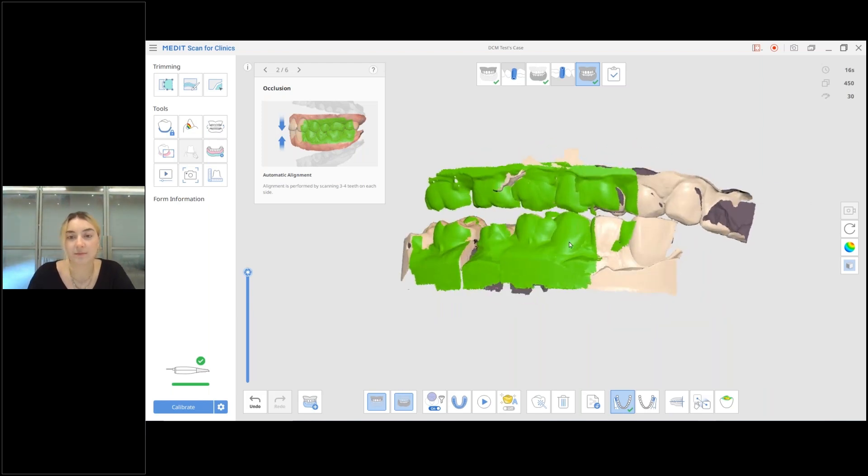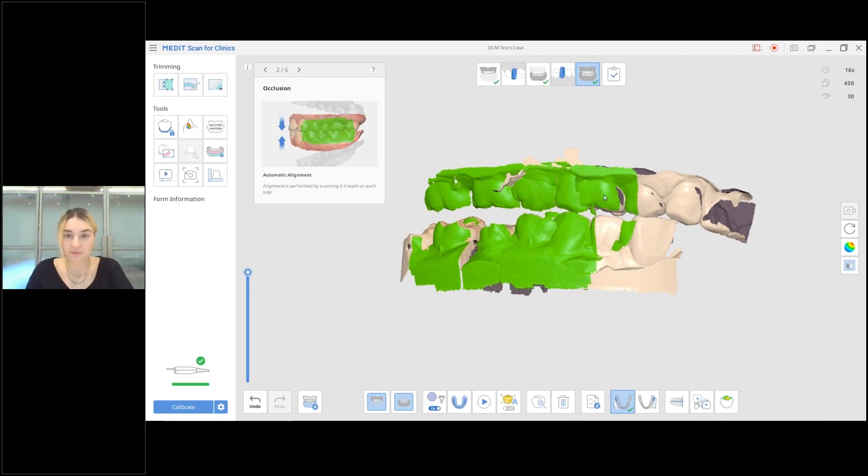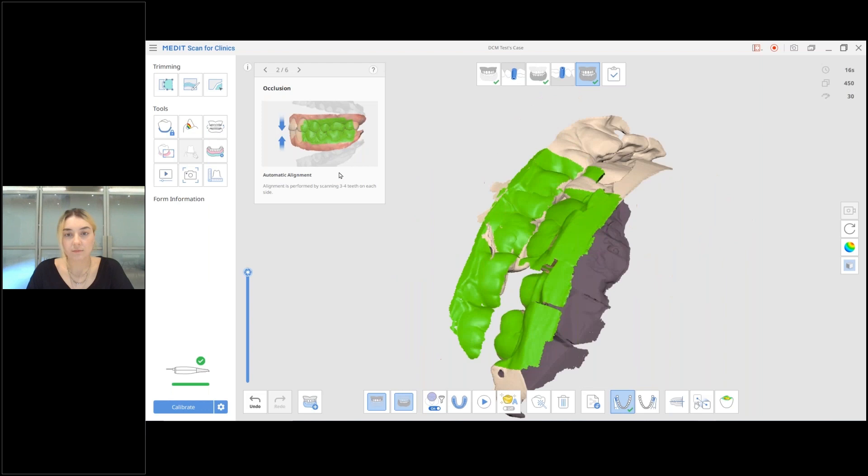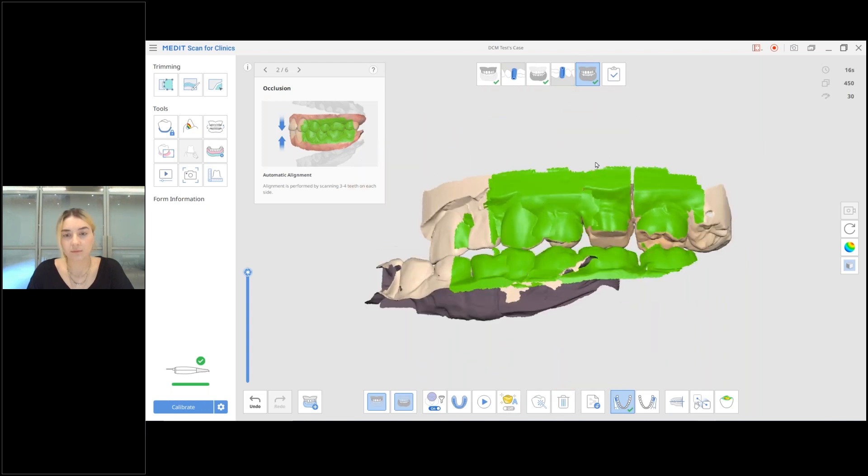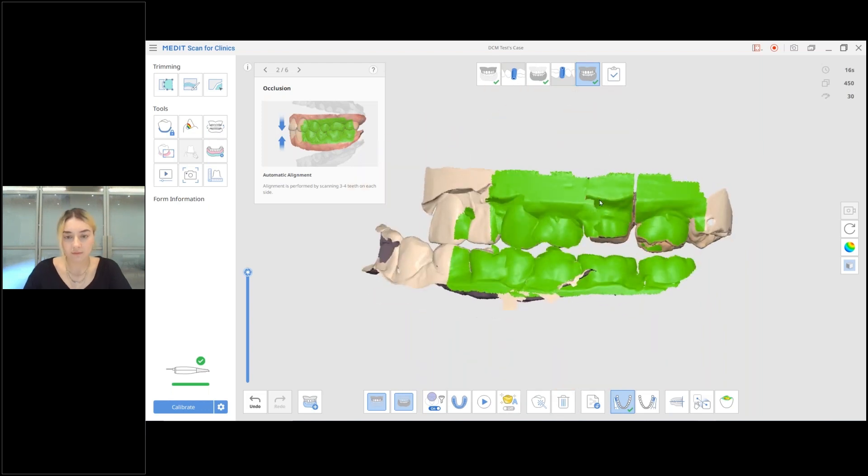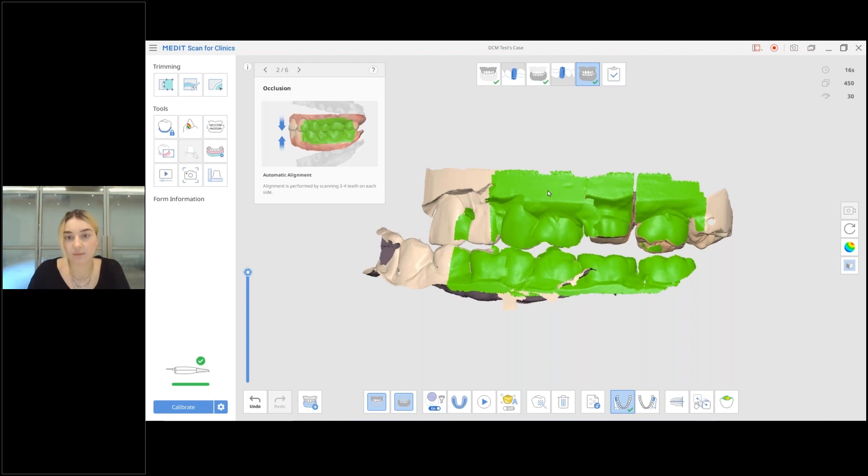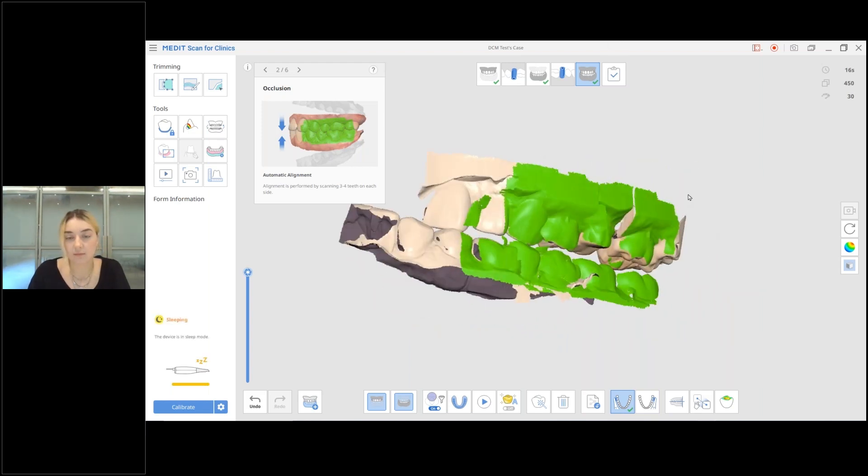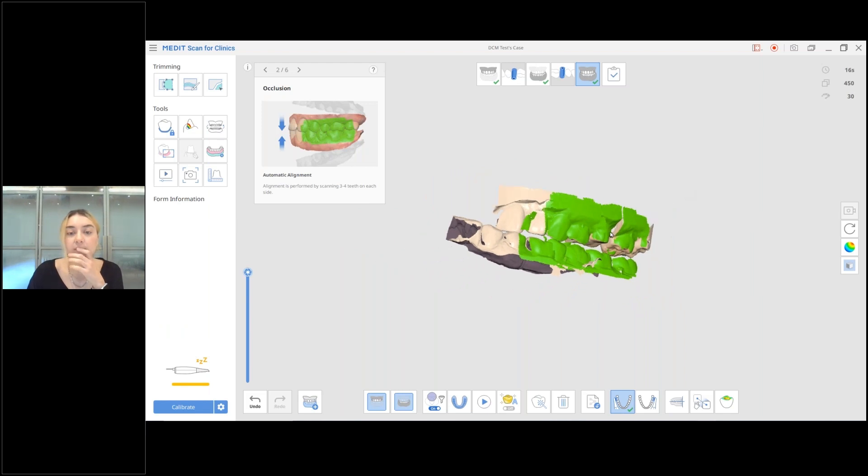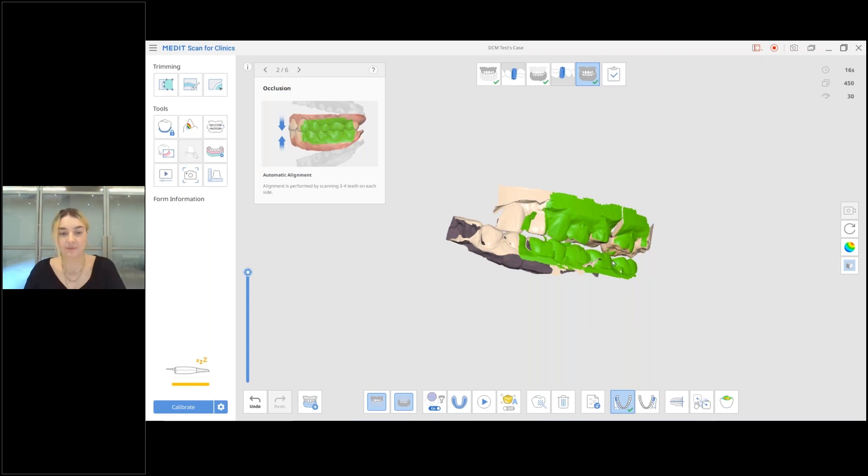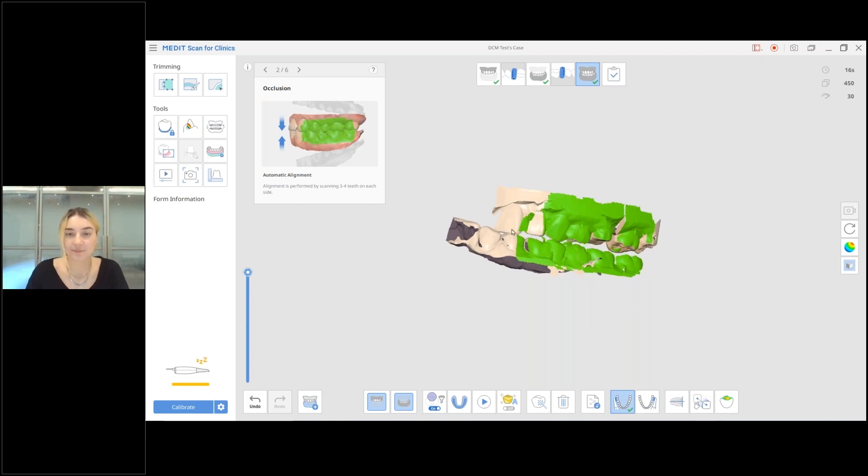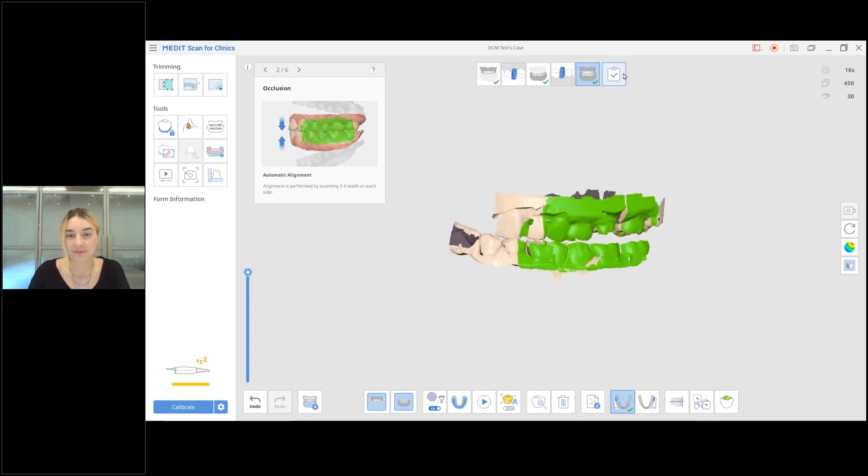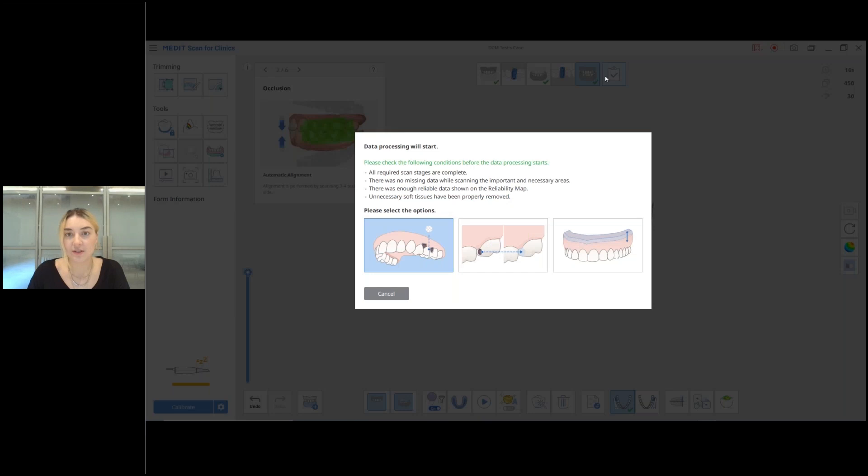That's a really good point with occlusion. When you're having difficulty with occlusion, always check your buccal surfaces. We're just going to throw in some pointers here as we go throughout the webinars. If you're having difficulty picking up a buccal occlusion or an occlusion, you're going to want to check your buccal scans to make sure that they're clear and solid and they don't have a lot of holes. That will help occlusion. What I wanted to mention is we will have future webinars that we will be talking about how to manually occlude the arches if you're having issues because that occlusion could possibly be off just a little bit. We just really want to see how this DCM Converter works and how we can make changes to it.